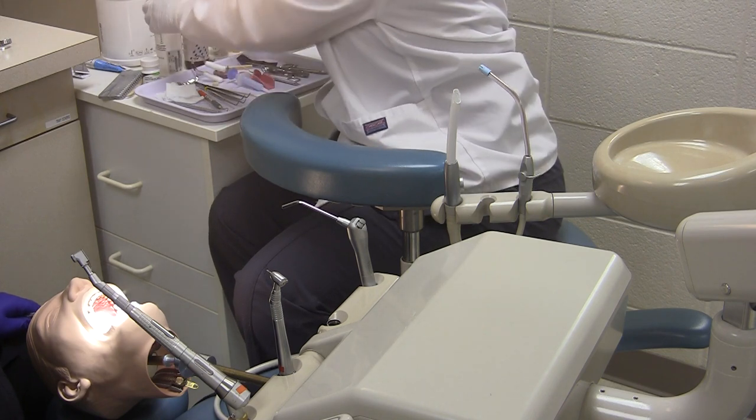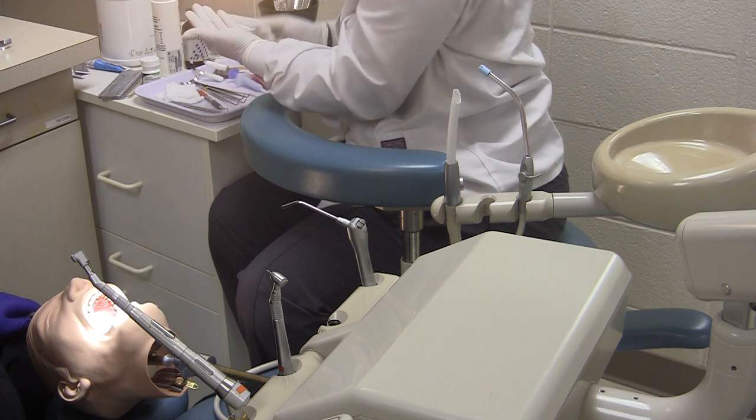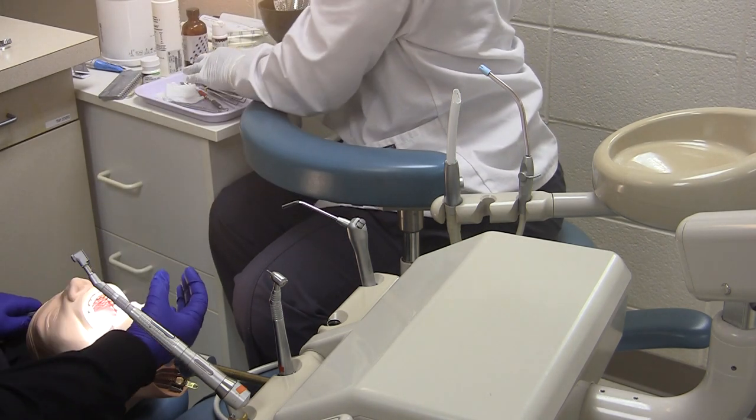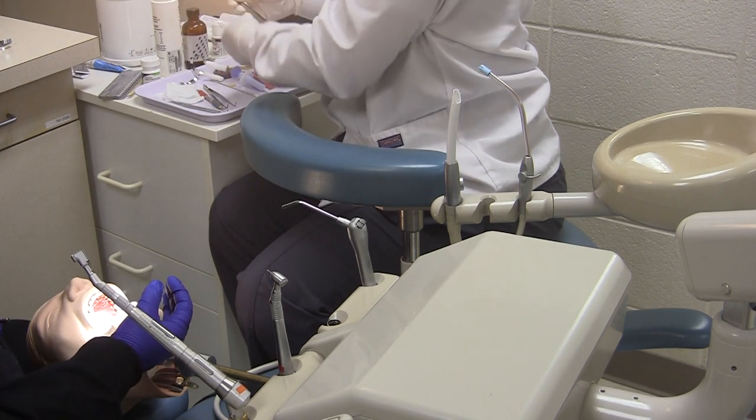The assistant should let the dentist know when the temporary is done and when they are ready to do the final impression. The assistant will then pass the cotton pliers back to the dentist to remove the retraction cord.